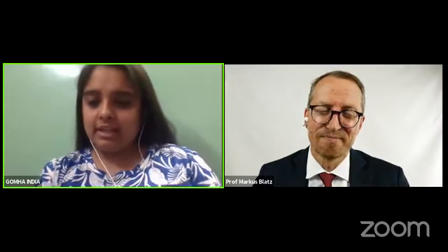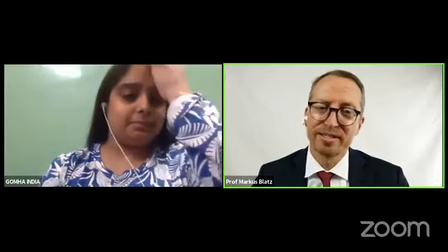Okay. So next question is, how do you remove a zirconia crown? What do you recommend? It just takes a coarse diamond, it takes lots of water, and it takes a lot of patience. It just takes time.